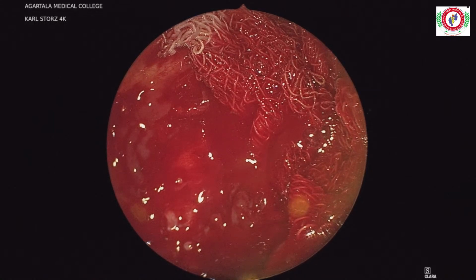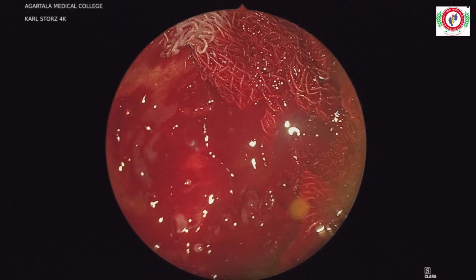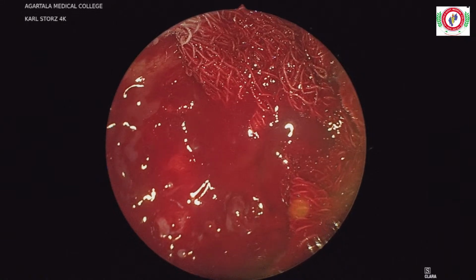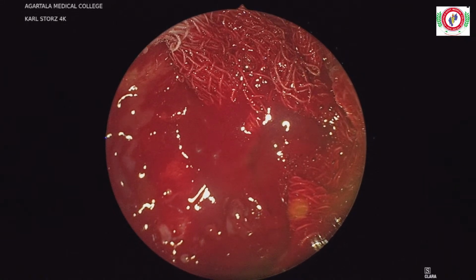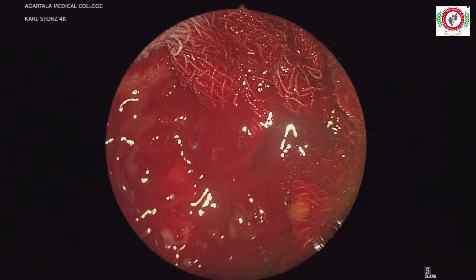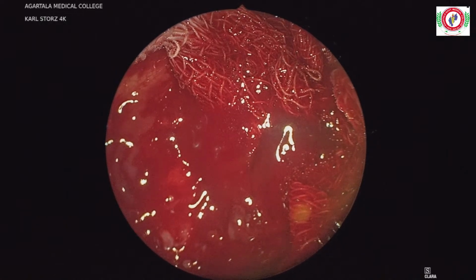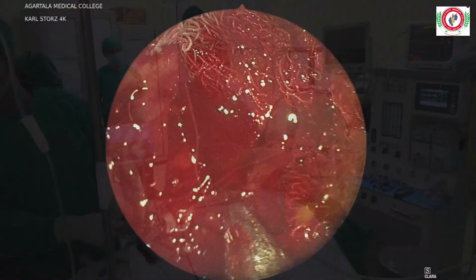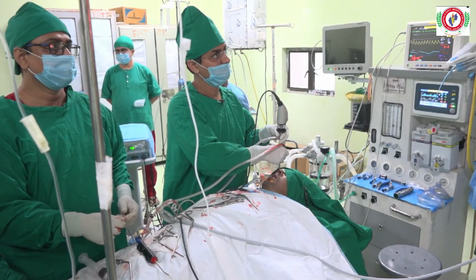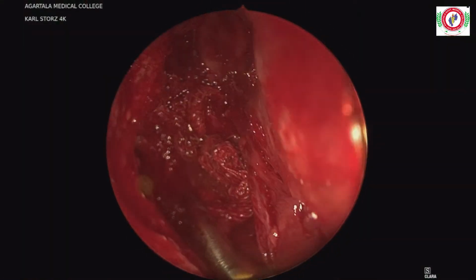Curved suction. I need a curved one, because I feel there is still some residual tumor there, maybe in bits. No curved suction? We have already removed the tumor from the pterygopalatine fossa.